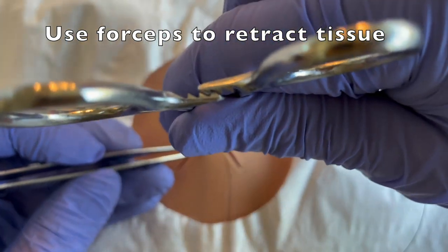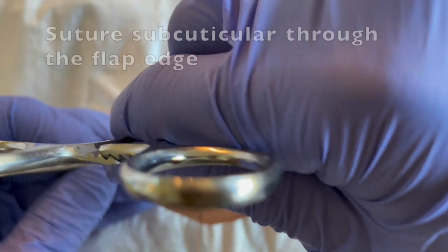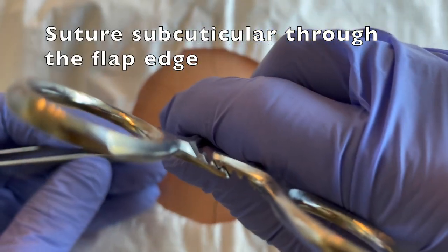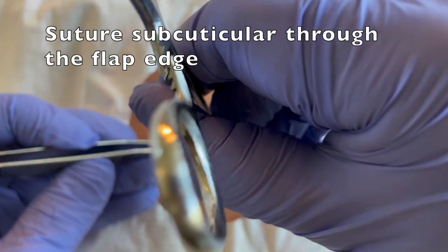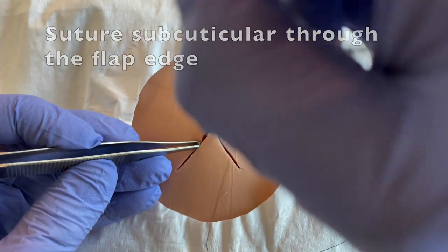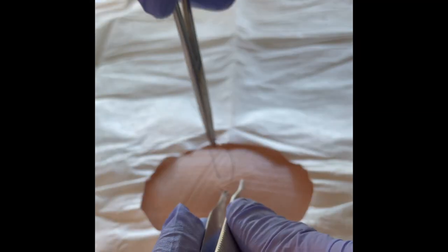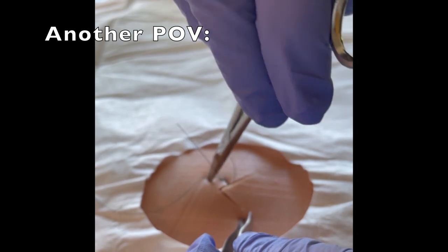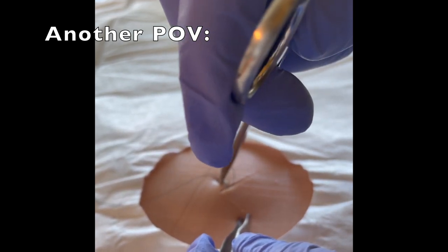You'll use your forceps to retract that tissue edge and you'll suture subcuticular through that flap edge. This is a bird's eye view of what your hands will look like. Here's another point of view to demonstrate how this technique will look.